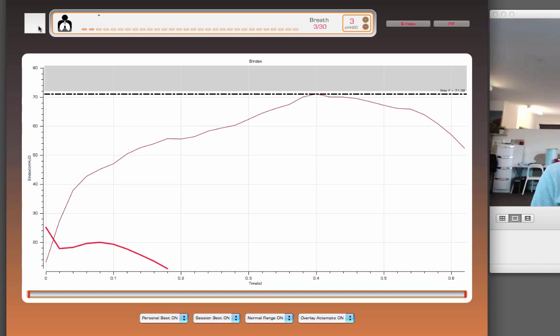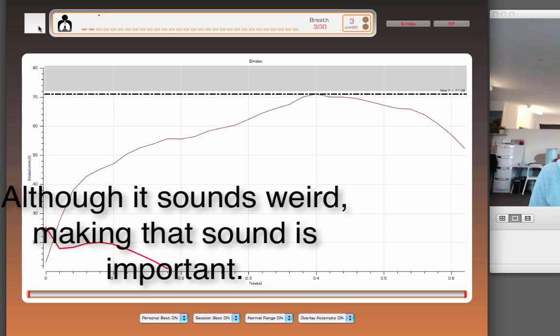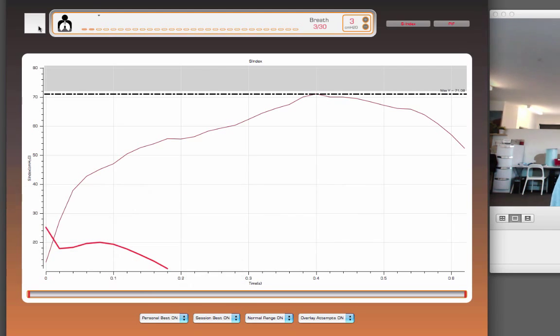So something like this. So breathing all the way out and really, really hard. Okay? So have another go. It was a good first effort, but we can do better. Okay. So all the way out. Squeeze all that air out. Nice and straight then. Really hard and fast.